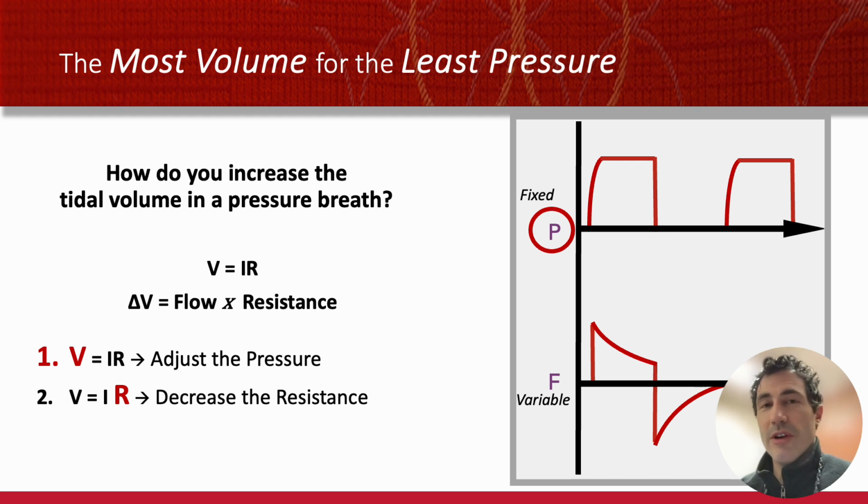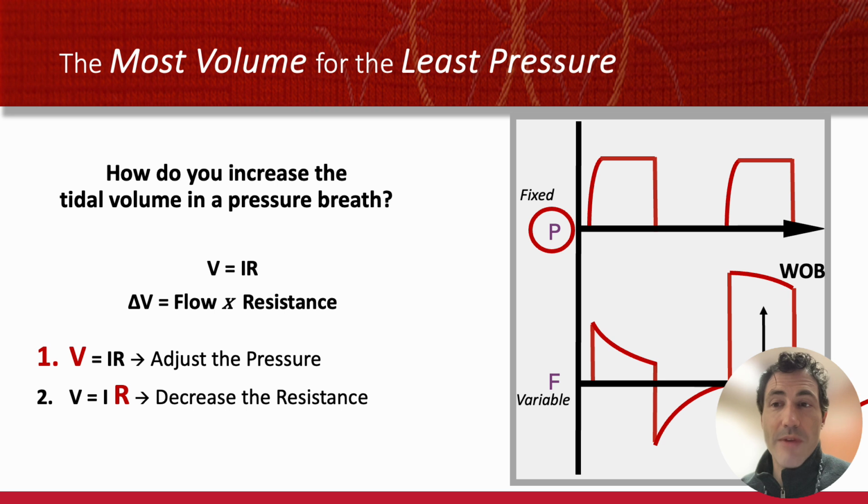conditions, by making the lung better, healthier, diuresing, treating chest wall edema, taking patients that have belly weight, sitting them upright a little bit, and all of those things for the same pressure will look just like that pattern from increasing the pressure, right? The same phenomenon. You get more flow, but this time for the same pressure. If the patient takes that to the next level, you can see increased work of breathing by looking for that jumping off a cliff waveform, and even flow starvation where the vent can't keep up on the pressure waveform.